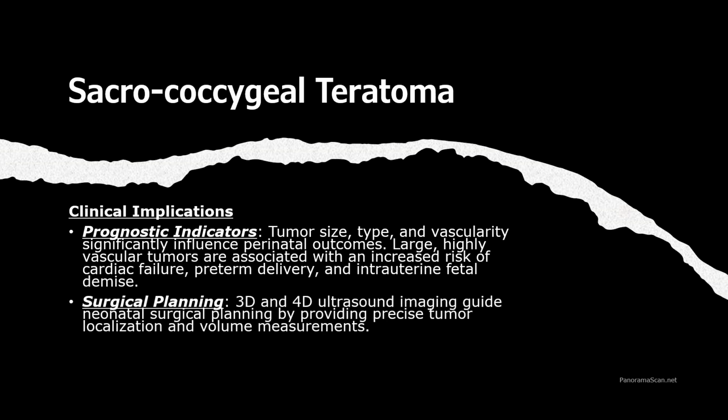The detailed insights provided by 3D and 4D ultrasound are invaluable for neonatal surgical planning. These imaging techniques help identify the precise location, size, and vascularity of the tumor, allowing for more targeted surgical approaches.